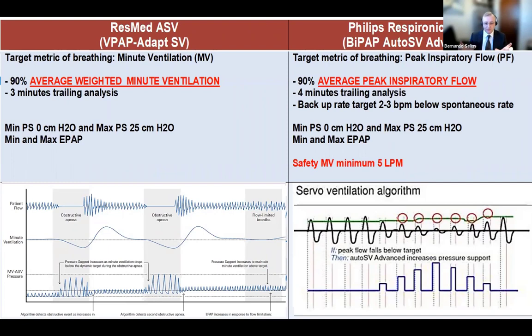The windows are kind of similar, the pressure support is kind of similar, and the EPAP is quite similar. Respironics has a safety feature for minimal minute ventilation, and if you ask me later, I'm going to explain why that is in these devices. But let's go to the graphic. It's much better for me.